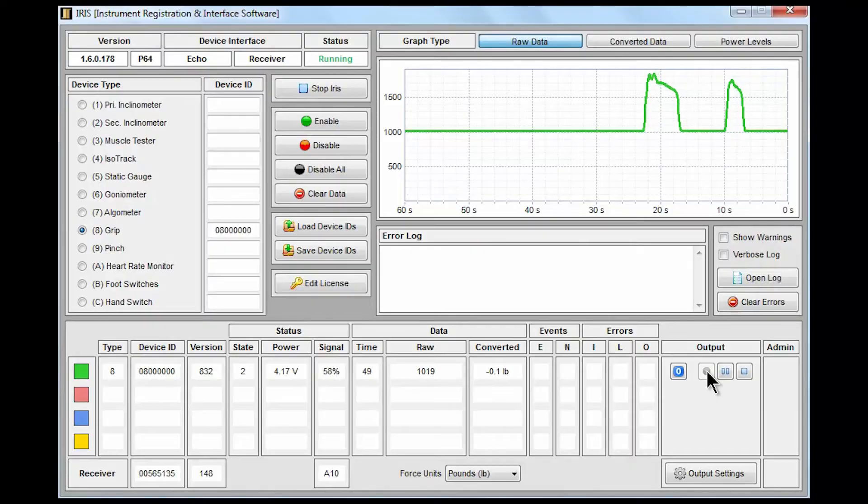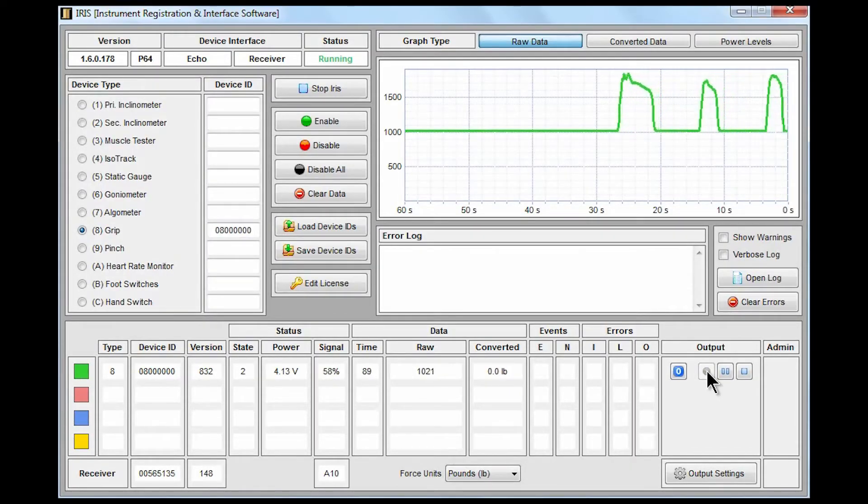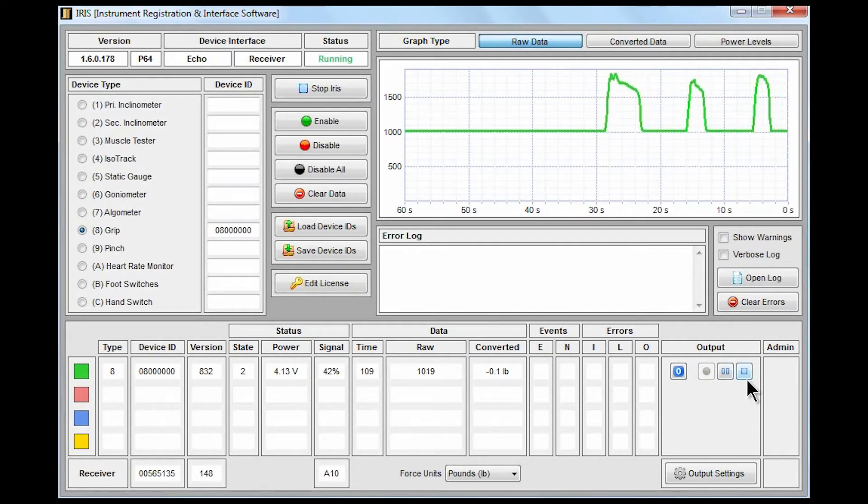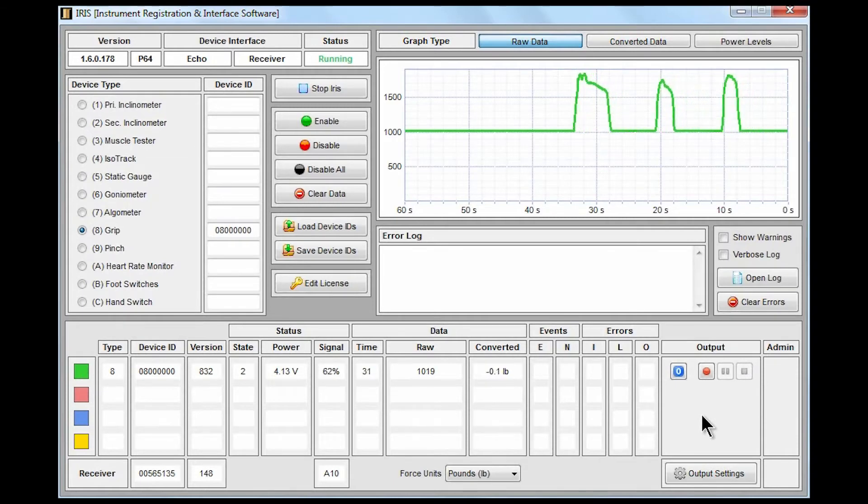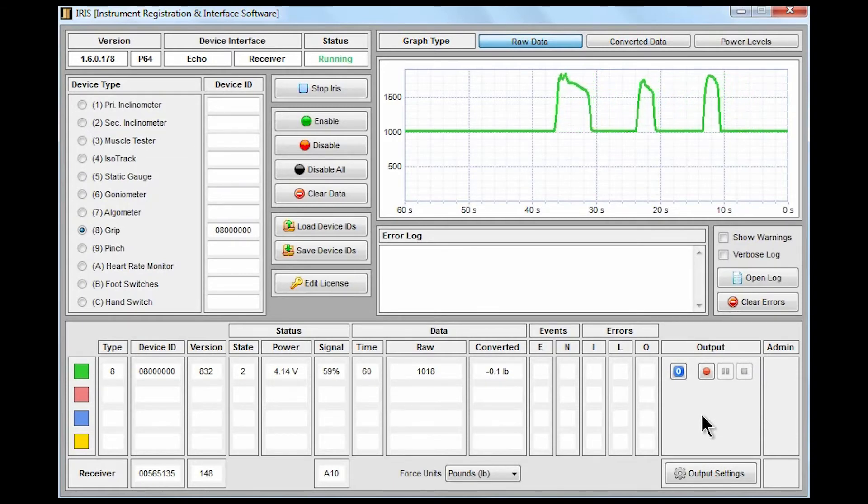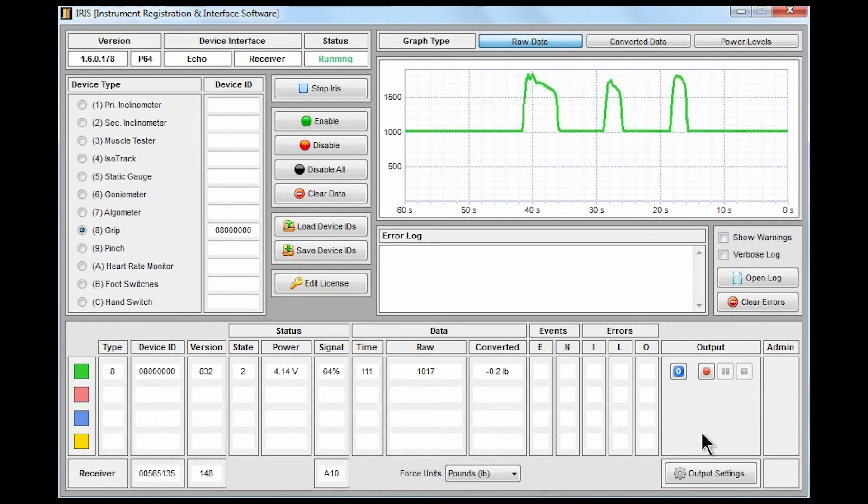Once we have put in a few repetitions or whatever our output is that we desired, we can click on the stop button to stop recording data. The device of course continues to read from the wireless gauge but our output file now has been completed. So let's take a look and see what that output actually looks like.